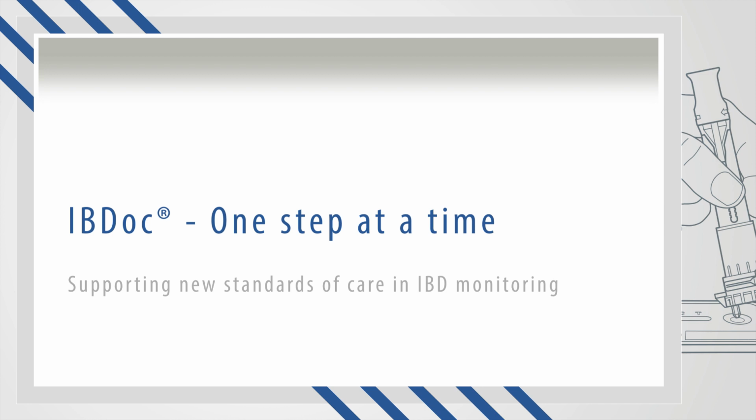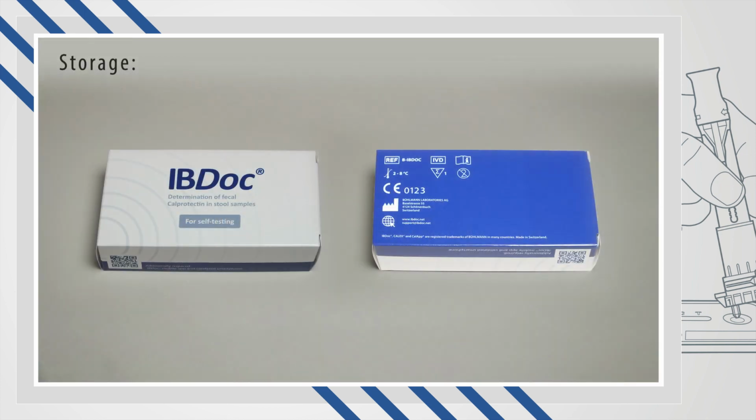You've been asked to do a fecal calprotectin test using the new IBDoc home test on your smartphone. The IBDoc kit needs to be stored in the fridge until you're ready to use it. It's completely sealed and doesn't contain anything toxic.